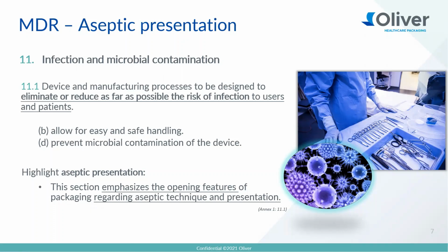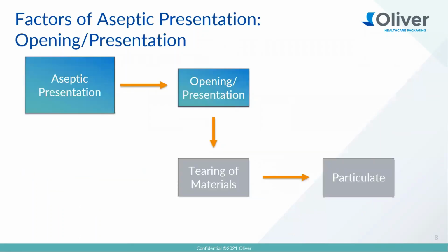So MDR emphasizes and talks more about devices and not as much about packaging, but this is an opportunity that highlights aseptic presentation and packaging. So it emphasizes the opening feature of the packaging and the aseptic presentation and technique that you have when you're opening the package. So Tommy, when we're talking about aseptic presentation, it often leads into discussions about opening and the presentation, and that's pretty standard. But then those discussions go into what if scenarios. What if the materials are tearing, and what if there's particulate being generated?